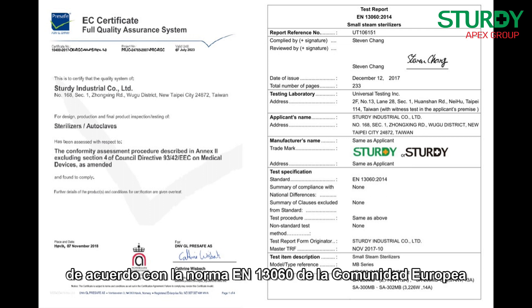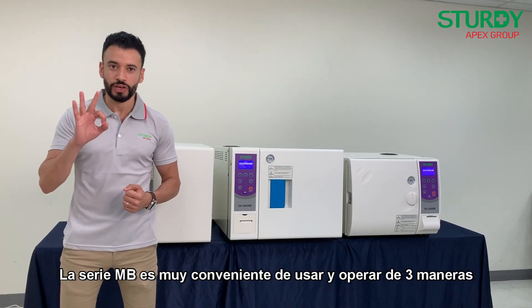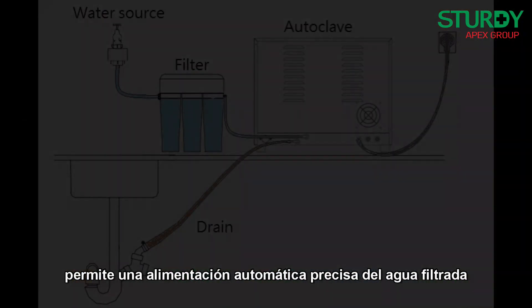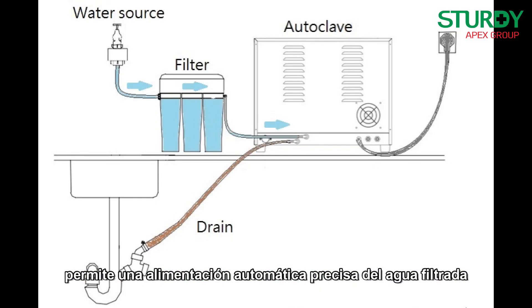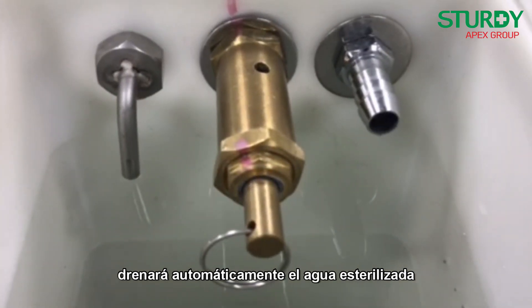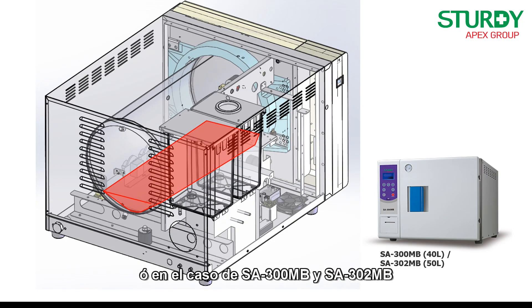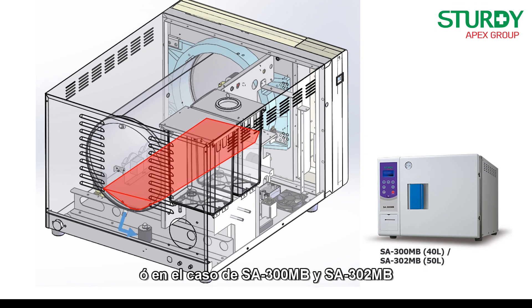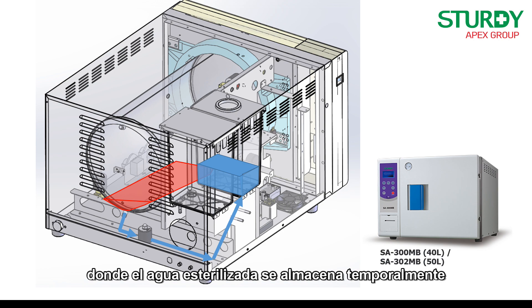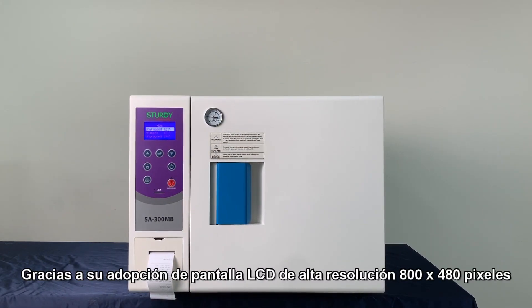According to EN 13060 of the European standard CE, the MB series is very convenient to use in three ways. In terms of hardware, its microprocessor control system enables precise automatic feeding of filtered water from a filtration system into the clean water reservoir. After the sterilization cycle, the SA 260 MB automatically drains the sterilized water, while the SA 300 MB and SA 302 MB return sterilized water to a used water reservoir, which automatically drains when full.